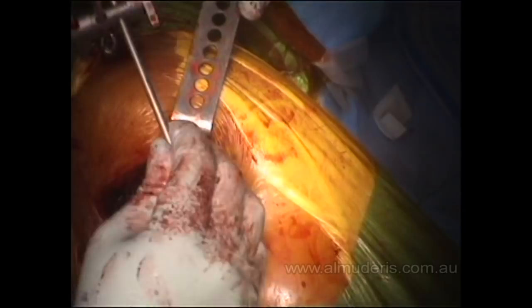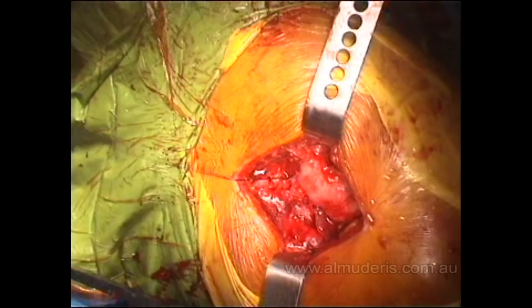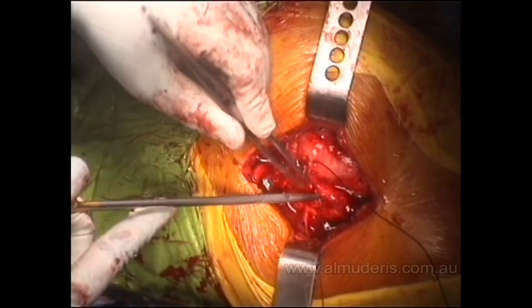With ceramic, the aim is to have 30 degrees of abduction and 30 degrees of flexion. The femoral head should be centered in the acetabulum, and that has been achieved. We then repair the lateral rotators.